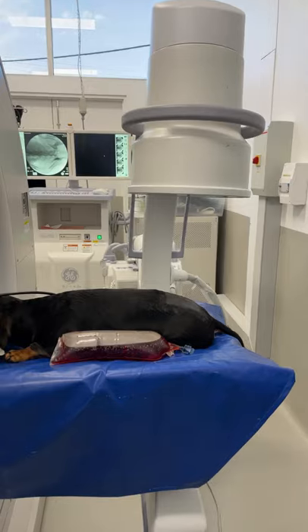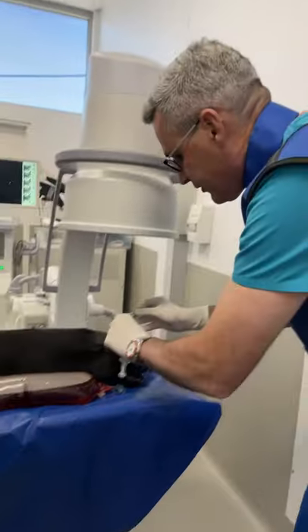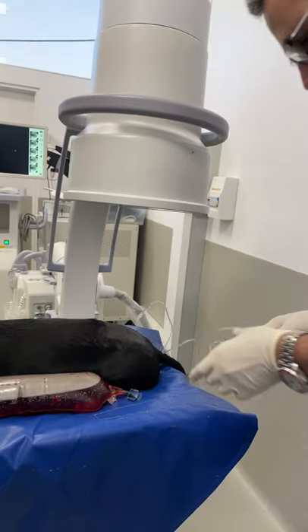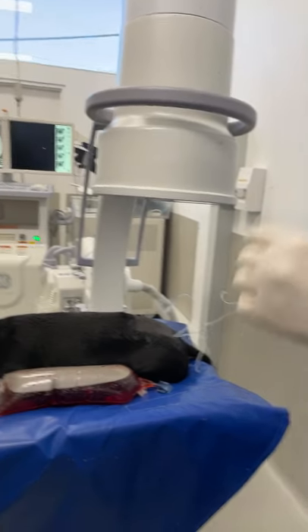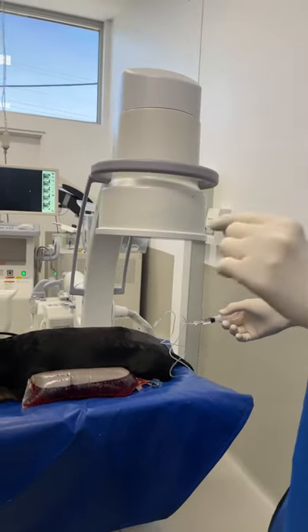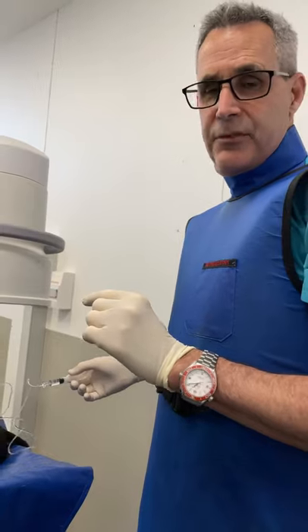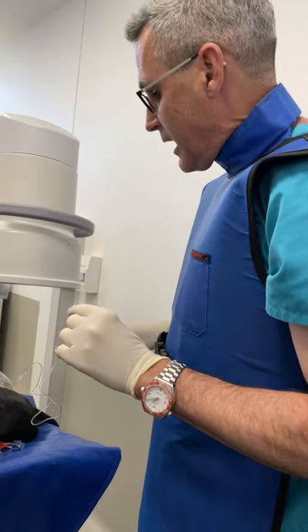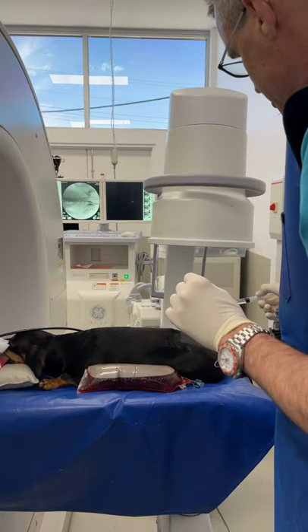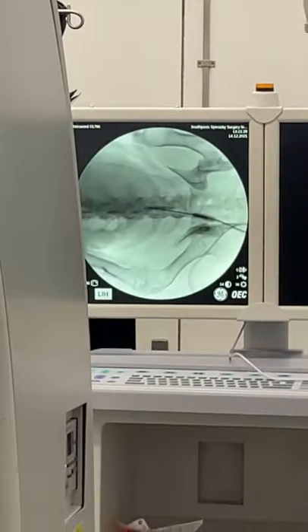If you don't get CSF coming out with your needle then you have to do test injections to see if you're in the correct space. So now I connect my contrast and the calculation that we use is 0.3 milliliters per kilogram plus whatever volume it takes to prime your tube. In this case it was about 4 mils and now I'm injecting slowly just to make sure that we've got a nice myelogram image.